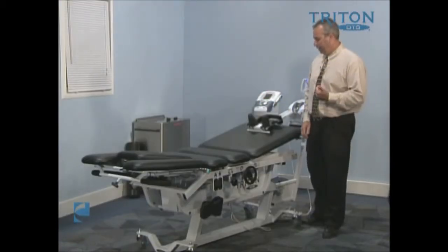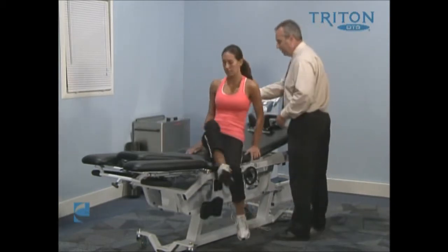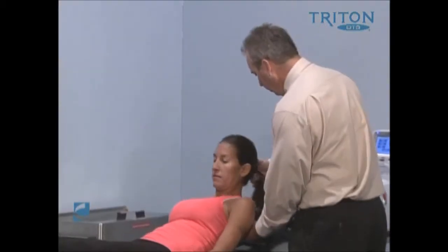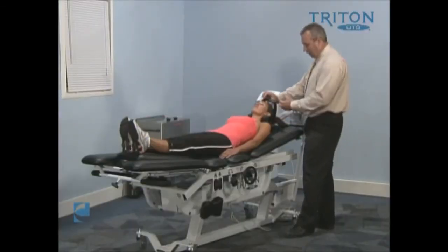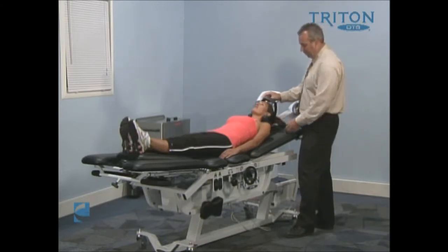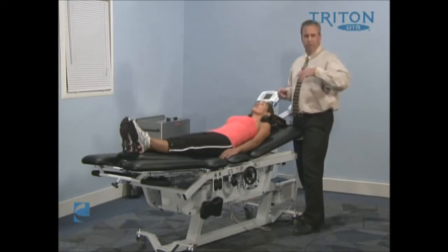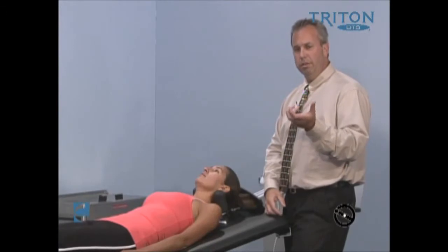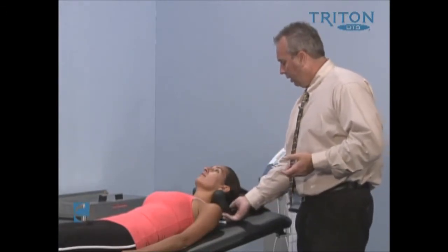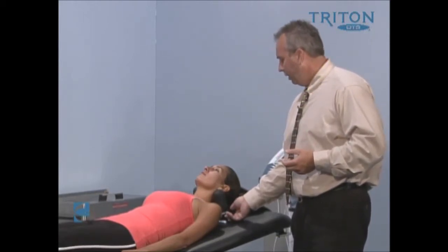We'll just have the patient come over and sit on the device facing us, then have them rotate around. If you need to assist the patient — patients with long hair, make sure the hair is back and away from the turn dials. We explained to patients that we're just looking for enough tension to grab the base of the occiput with these non-skid devices, and we're not trying to over squeeze their heads. As we turn the device, it will equally clamp from both sides.